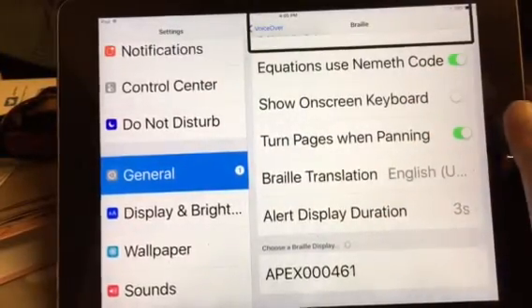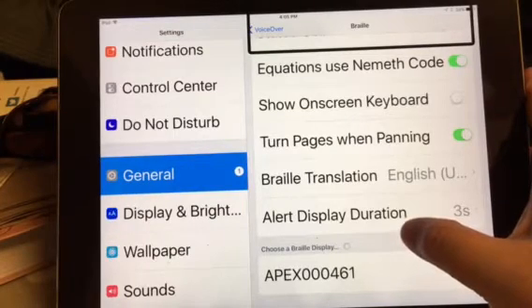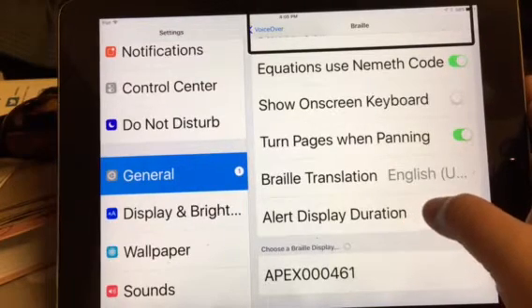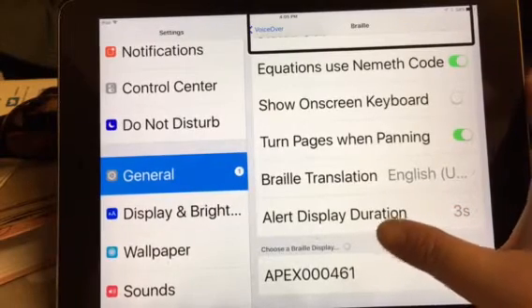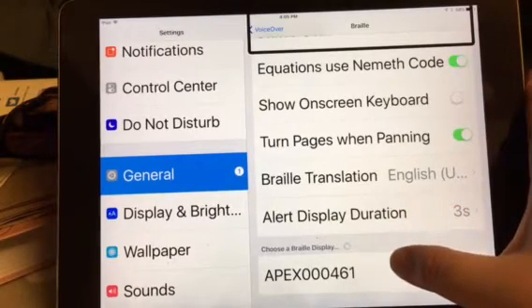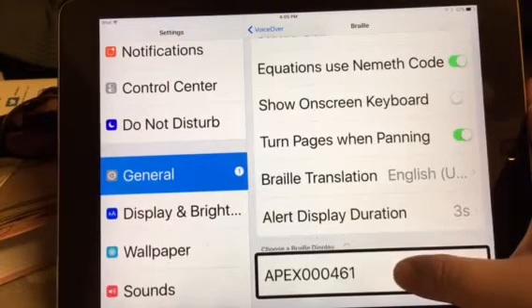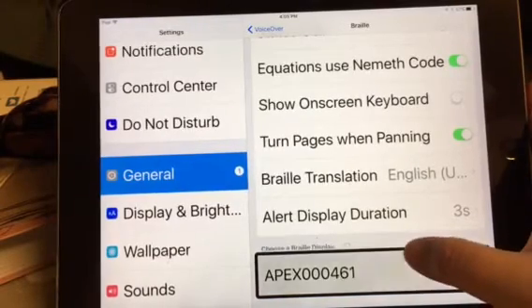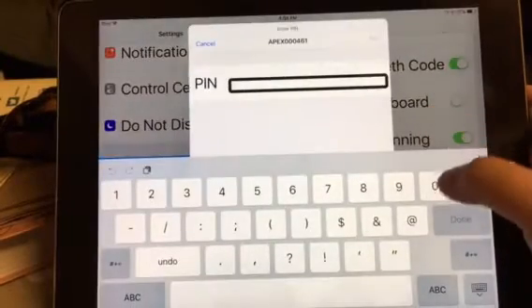A lot of times you have to press 0, 0, 0, 0, 0 to get it to connect, or it's 1, 2, 3, 4 — it just depends on the version of Apex you have. So I'm going to try that again. Apex pairing. Secure text field is empty.